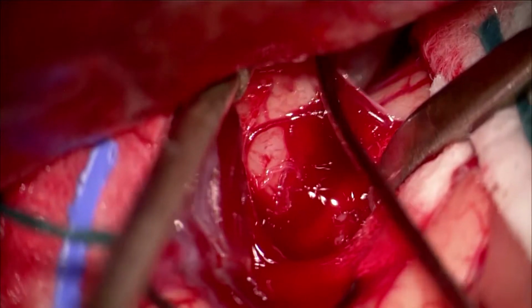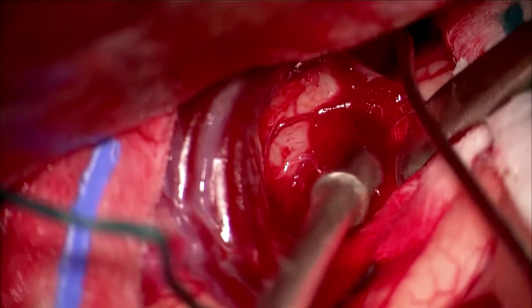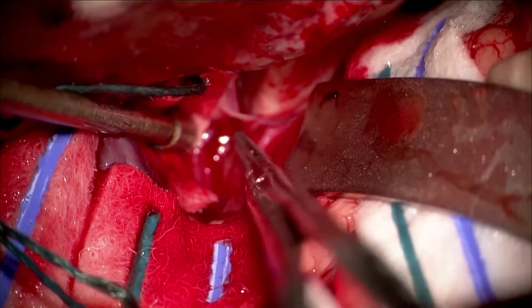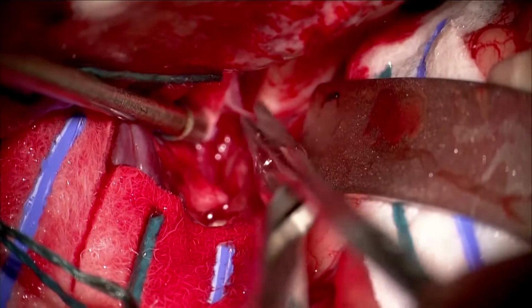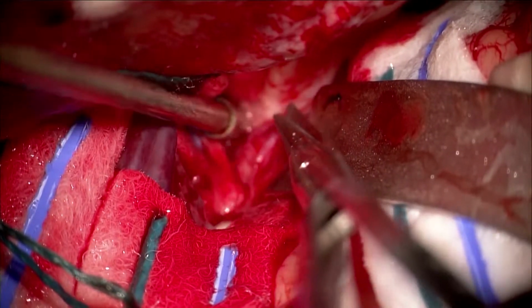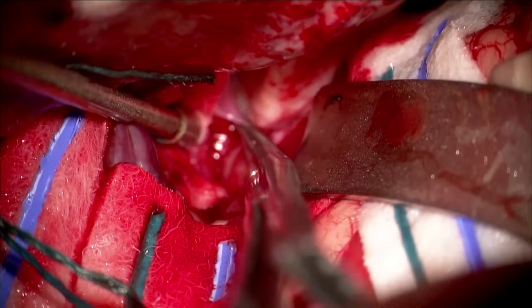As you can see, the vein now is quite superficial, and you can see more of the brain on either side. A retractor has been added on the right side to assist with retracting the patient's frontal lobe, and I'm continuing to open the sylvian fissure with the micro scissors.